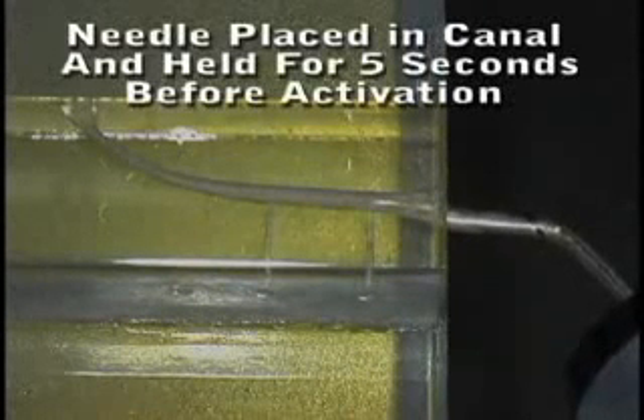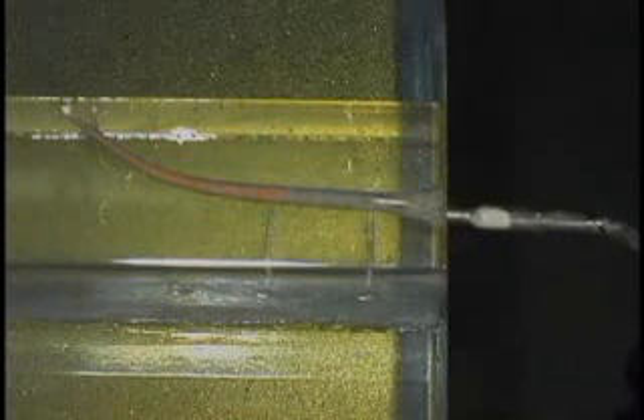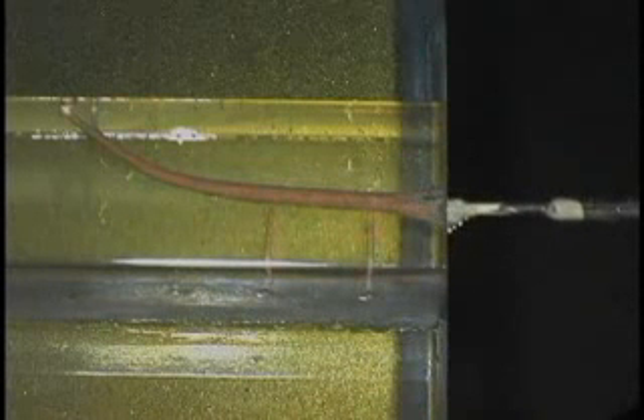The needle is placed in the canal and held for five seconds before activation. We're going to push the back end of the toggle so we have a slower extrusion rate. It will push the gutta percha apically and then start moving the needle out of the canal if you hold a light apical pressure on that needle. When it's back up to the orifice level, the needle is removed.